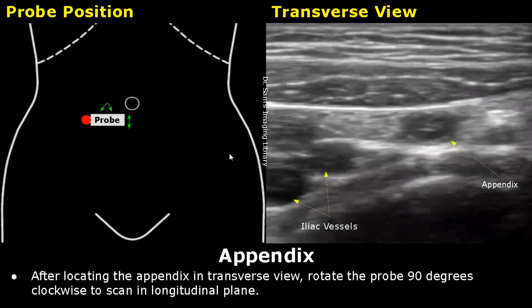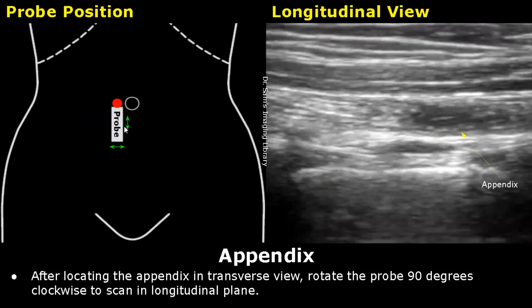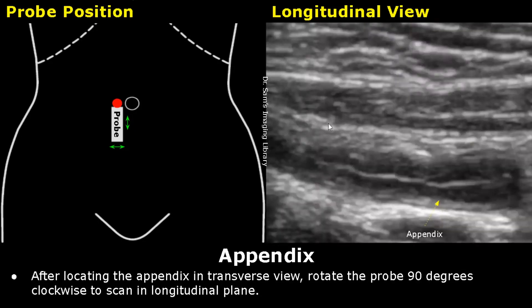After locating the appendix in transverse view, slowly rotate the probe 90 degrees clockwise to scan in the longitudinal plane. This is the image of the appendix in longitudinal plane — this tubular structure is the appendix. Slightly adjust the probe in this area to scan the end of the appendix as well. Here we can see the blind end of the appendix.